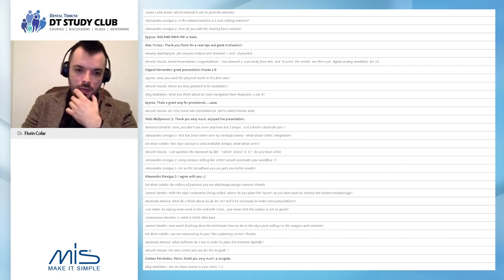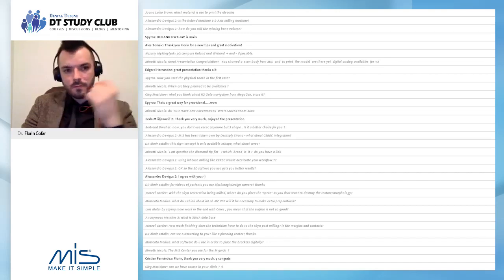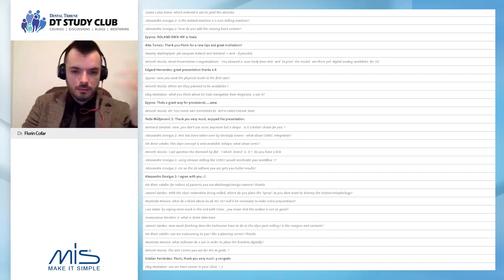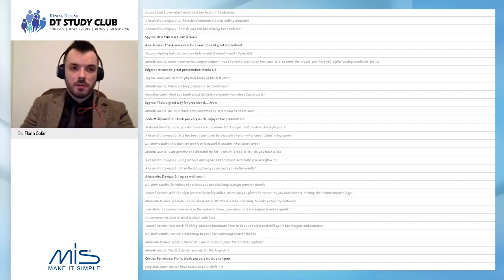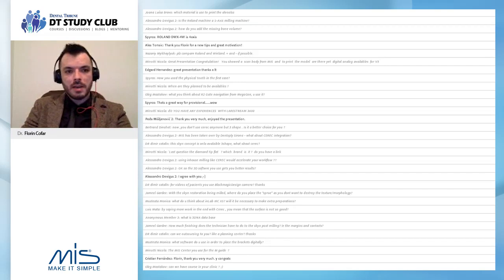So with Sirona, much faster in the first part, but then extra lab to get the same kind of result. So it's balanced at this point. It's just a matter of which advantage or disadvantage you prefer, because there's no universally better system at this point. There's just preferences. For me, this is my preference at this time.